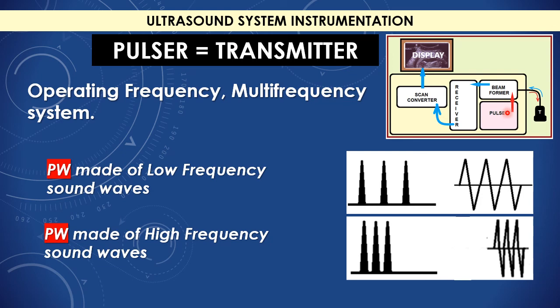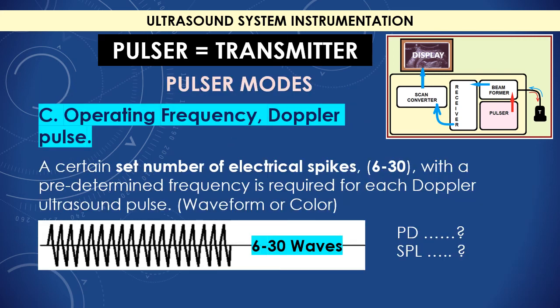Again, you mentioned we have a control key called the frequency, or sometimes called the resolution or penetration or other names. Another setting of the ultrasound system that we might apply is Doppler. We can apply Doppler either in color or spectral waveform.